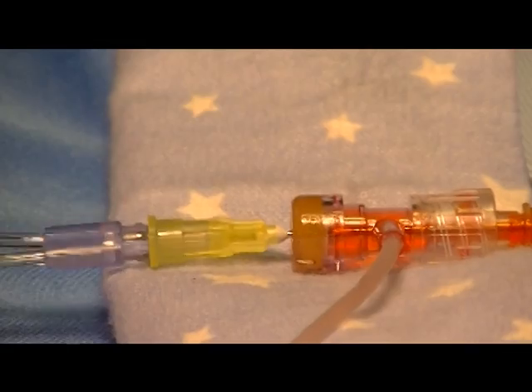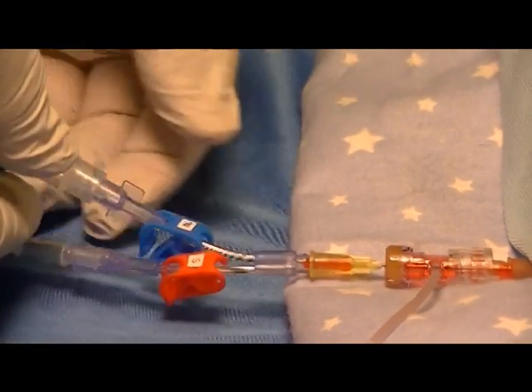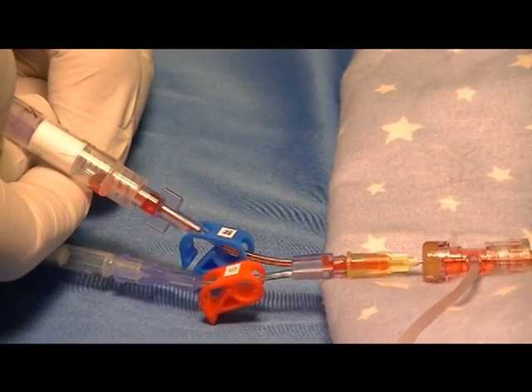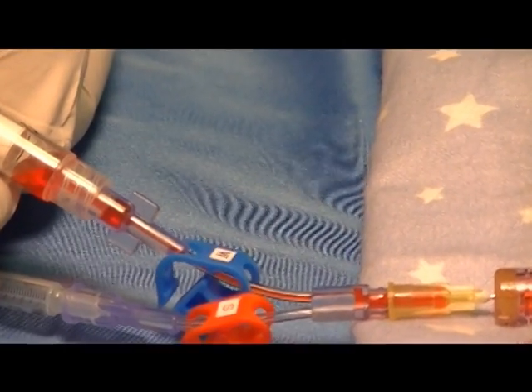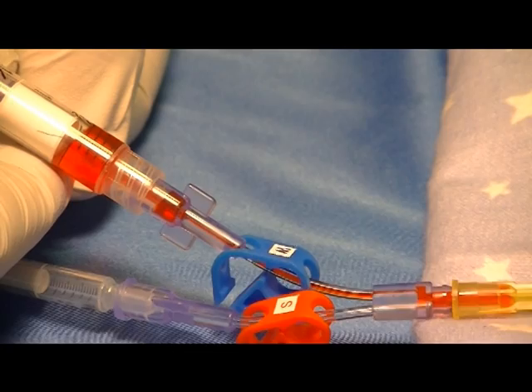At that point you would unclamp the waste clamp and hold the syringe at about a 30 degree angle, and allow the waste blood to come into the syringe and push all the air out of the waste.